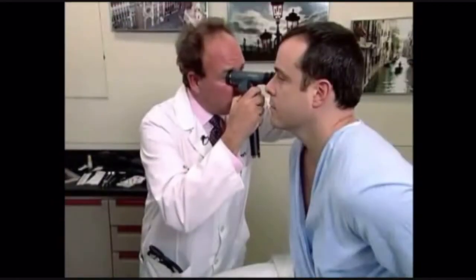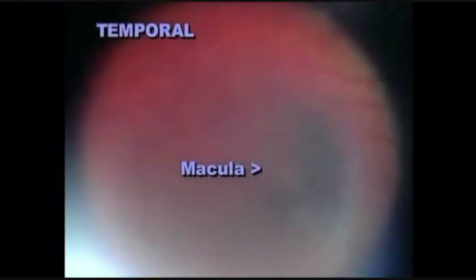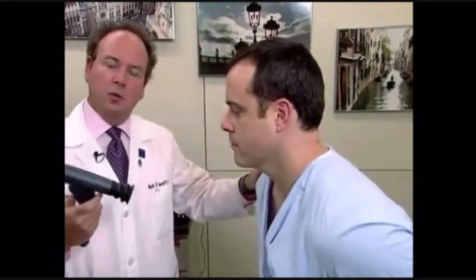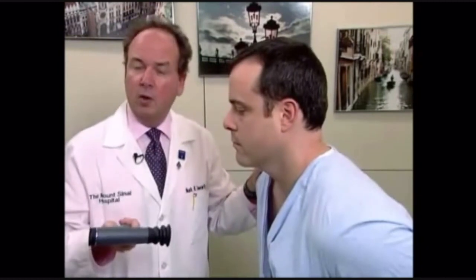The central retinal artery gives rise to four main branches that supply the superior and inferior aspects of the temporal and nasal quadrants of the optic fundus. And again, one will examine all of the quadrants as well as the macula in the standard fashion. A major advantage of this is that many individuals are one-eye dominant, and therefore may have trouble using their left eye to examine the left eye of the patient.